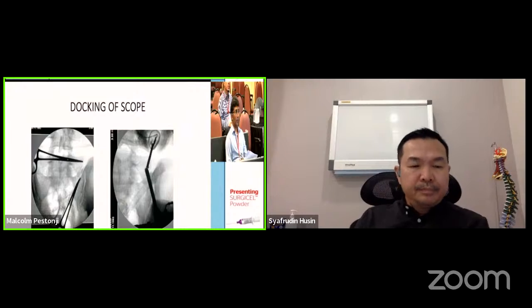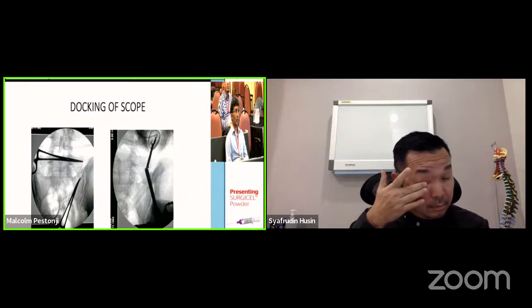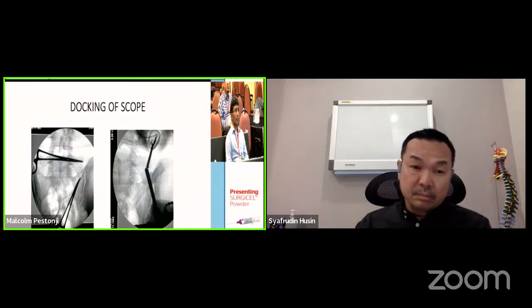I would like to demonstrate unilateral biportal endoscopy for treatment of Bertolotti syndrome. Under fluoroscopy, 2 portals were made, for viewing and working, over the pseudo joint at a 2.5 centimeter distance, and soft tissue clearance and triangulation were made in the standard manner and checked with a C-arm.